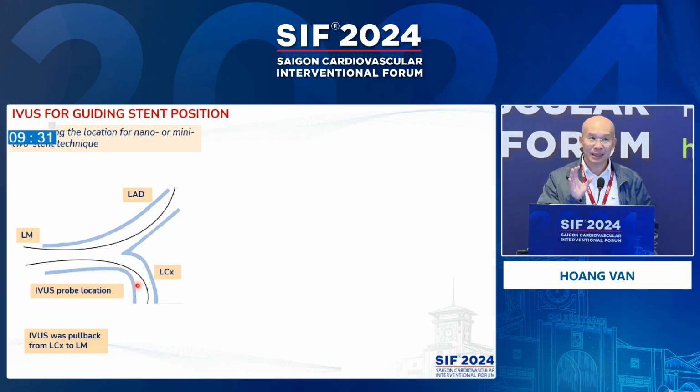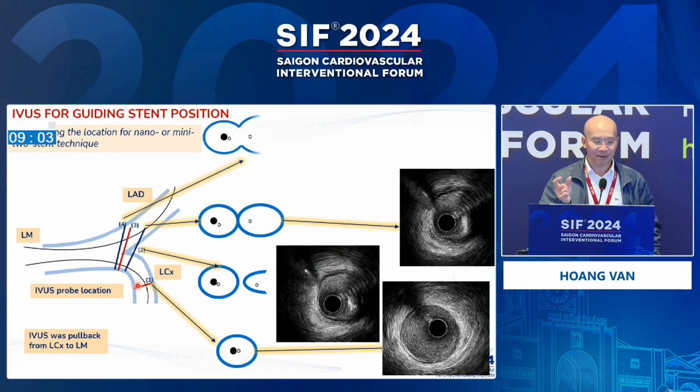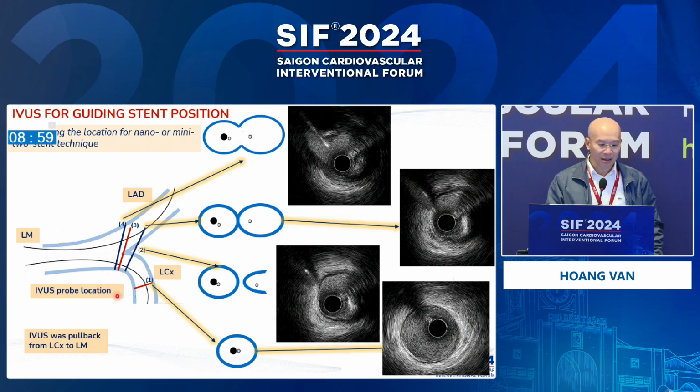And when we treat lesions, we make a detailed plan for the procedure. In clinical practice, sometimes we don't know where to position the stent in the side branch. In this case, around the bifurcation you can see three lines. The red line comes over the carina, but this is not a good position for the stent in the side branch because it is not complete coverage. But at number 4, you can see the good position of the stent because it gives full, complete coverage of the circumferential ostium.